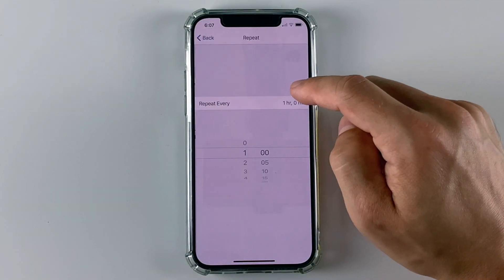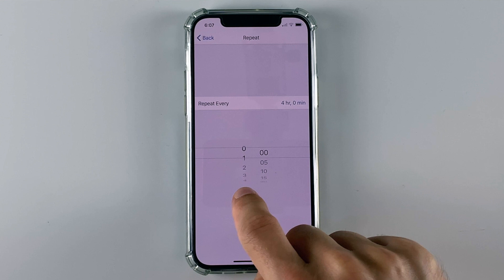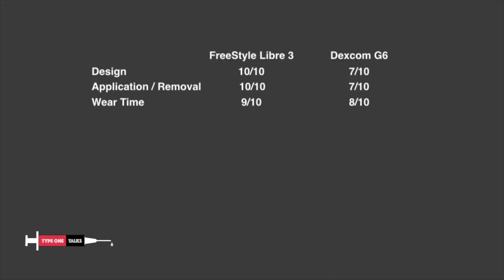I like the Dexcom G6 alarms a lot better because you can better customize them to your needs — they are more flexible. For example, they have a repeat function and you can set the exact length of the snooze period, which I find extremely helpful. Dexcom also offers a lot more sound options for your alarms compared to Freestyle Libre. So in terms of Bluetooth reliability and alarms, Dexcom G6 is the winner. Libre 3 gets 8 out of 10 and Dexcom G6 gets 9 out of 10.